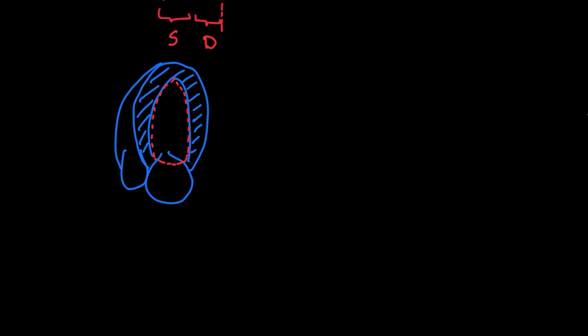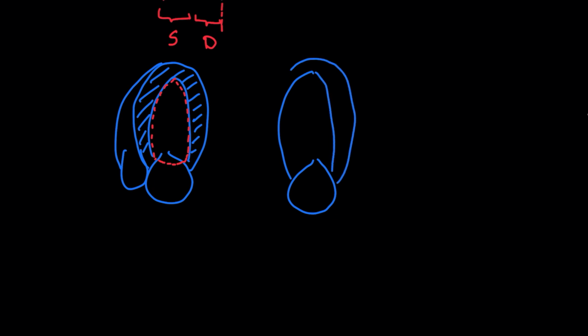Let's rotate our probe 60 degrees and again measure. So this would be in our apical two-chamber, and you'll still have this thick left ventricle. Let's make that a little more symmetric, something like that. Thick left ventricle and a smaller cavity inside than we measured at end diastole.